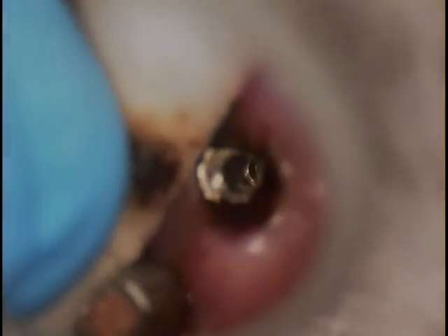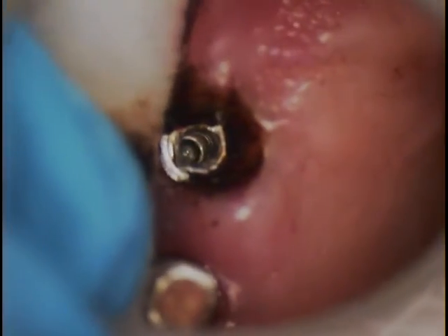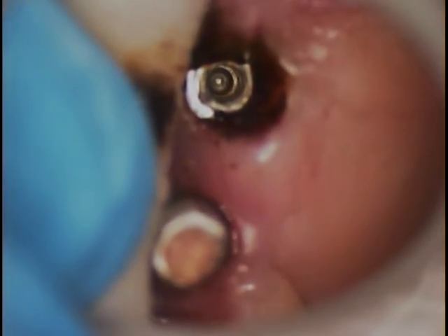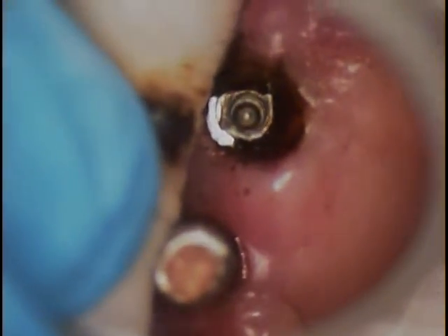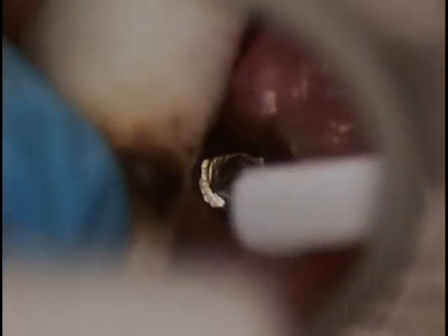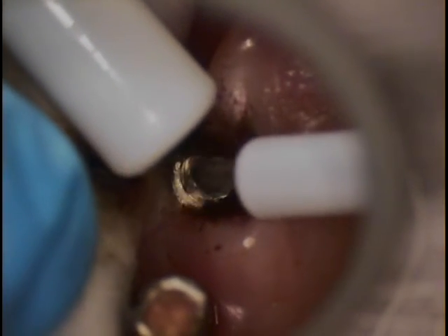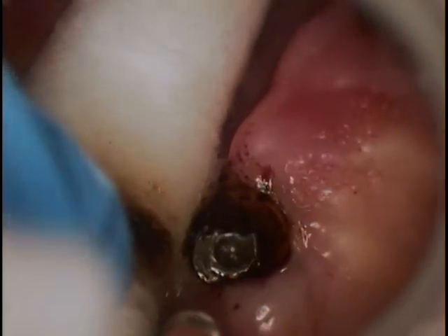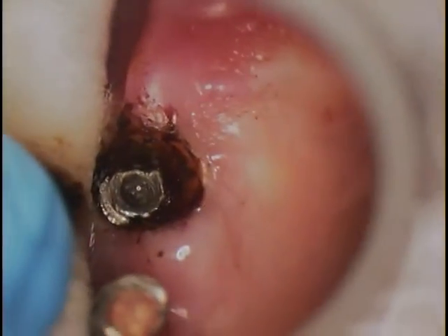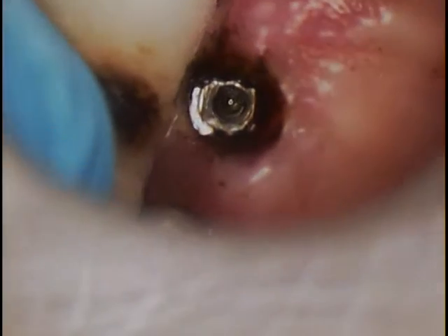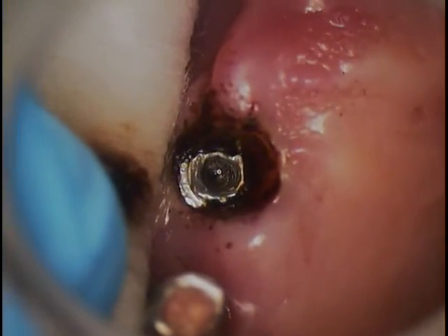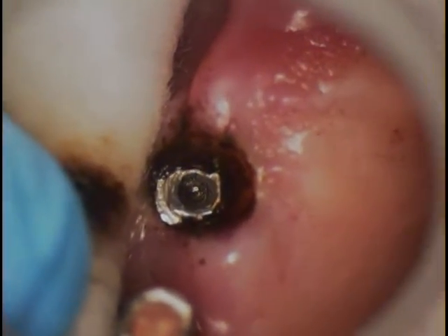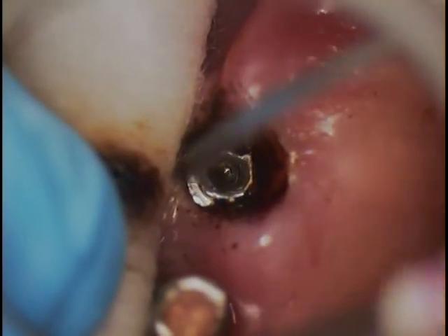That might be the bottom, but let's measure the depth. I'm going to rinse that out. It could be filings in there. We're going to pre-soak that again and micro suction that out.